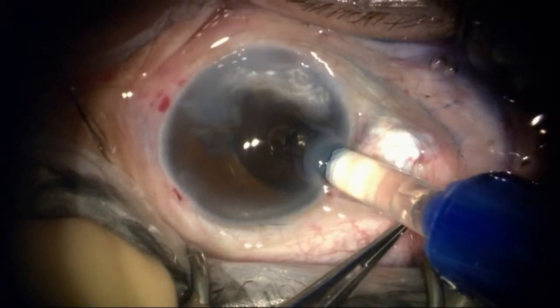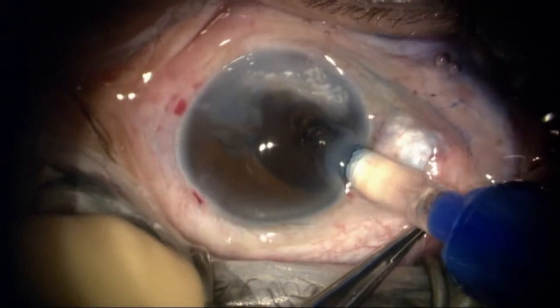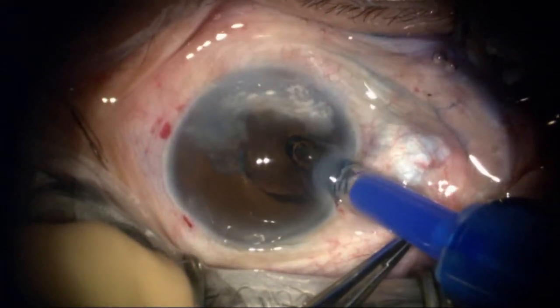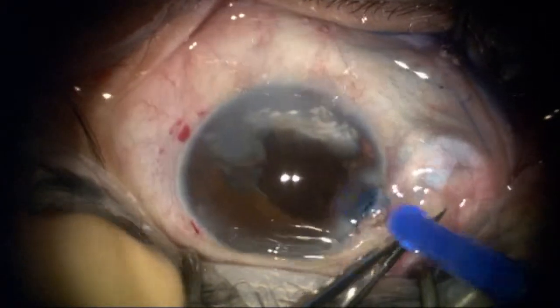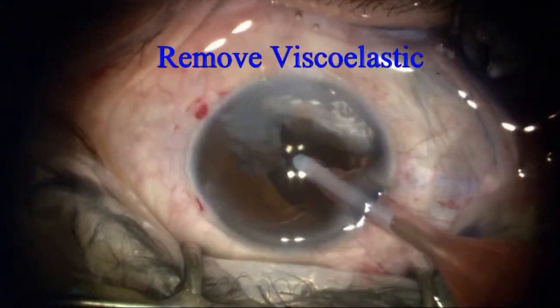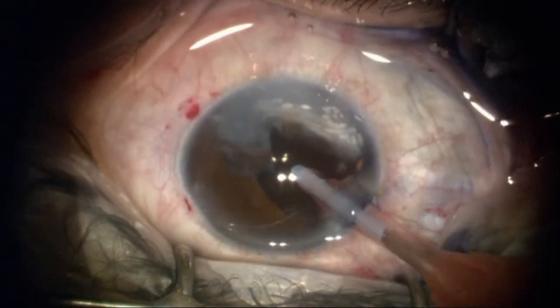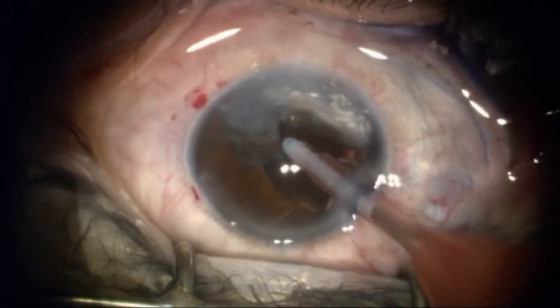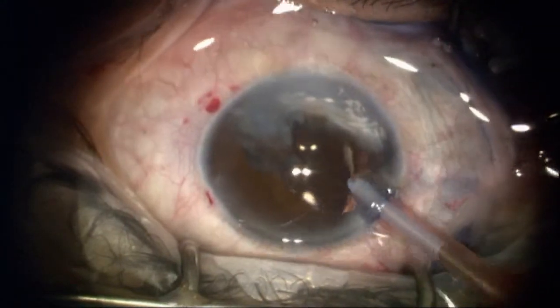This is the one-piece plate haptic IOL that I'm putting in. This is a good lens for this case since the capsule seems to be pretty strong and restored with the capsular tension ring. I'm going to do a lot of tapping of the optic here to get the cohesive viscoelastic out from behind it. This gentle tapping technique also lets me confirm that the lens is well seated and secure.